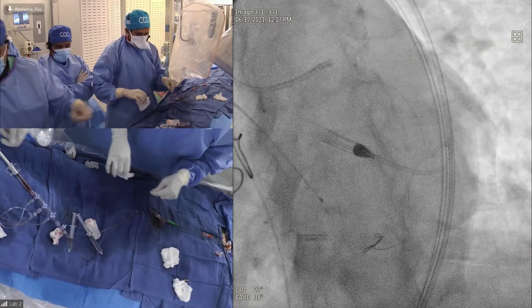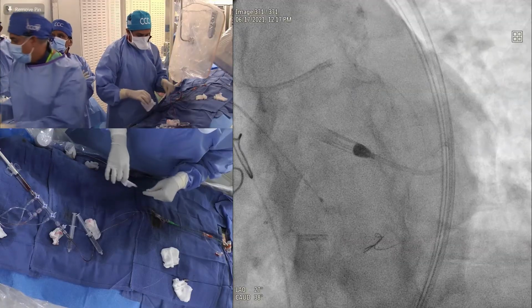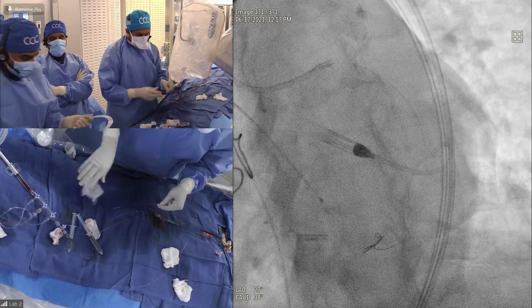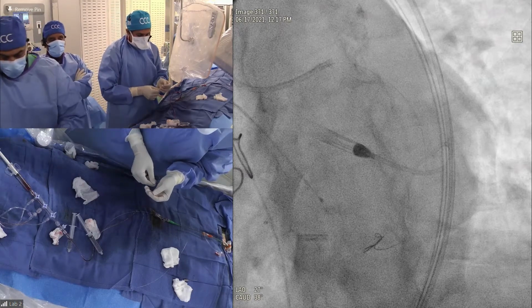So now you put the wire into the exact place where it was supposed to be. Yeah. So now the balloon will go. Now balloon, and it should go. The other question is to remove the rotor wire out.